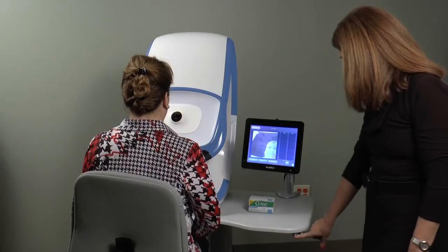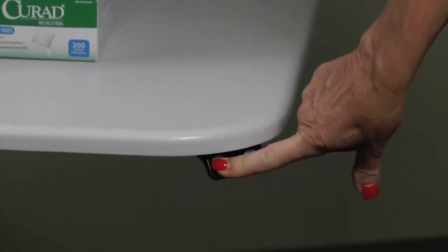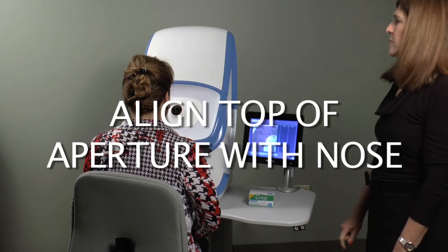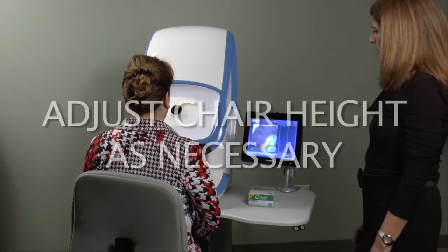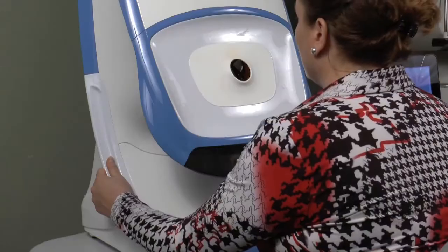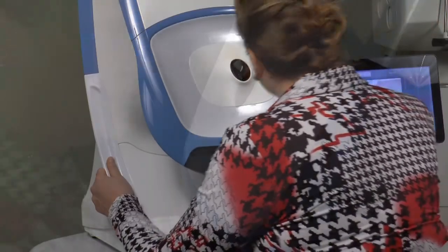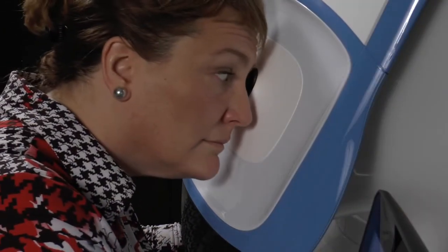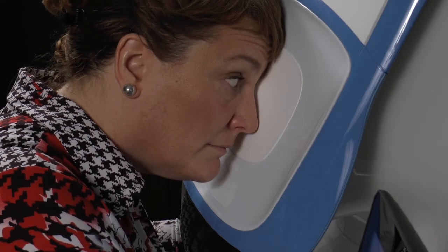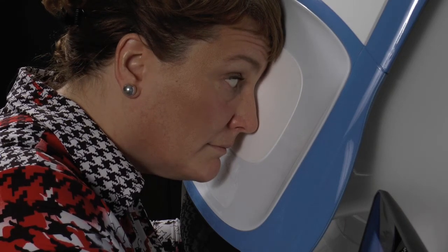If you are using an adjustable table, set the height to allow the patient to visualize the blue alignment target inside the eye opening from where they are sitting. If you are using an adjustable chair, set the chair height to allow the safe movement of the patient in toward the instrument. Have the patient hold the hand grips on each side and move forward, keeping the light in the center of their field of view with both eyes open, pressing their forehead in and rolling their cheek until the light goes green.